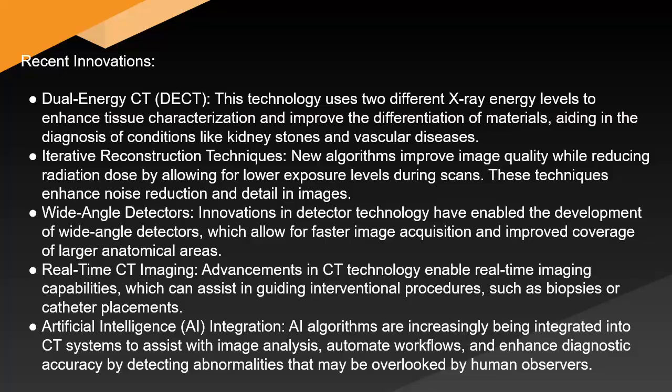AI algorithms are increasingly being integrated into CT systems to assist with image analysis, automate workflows, and enhance diagnostic accuracy by detecting abnormalities that may be overlooked by human observers.